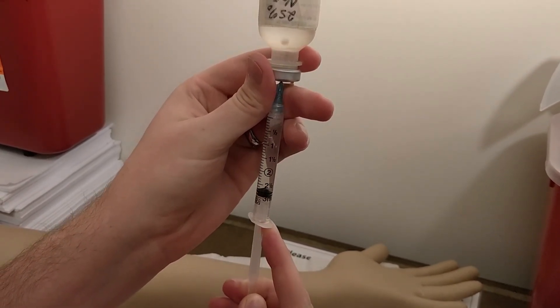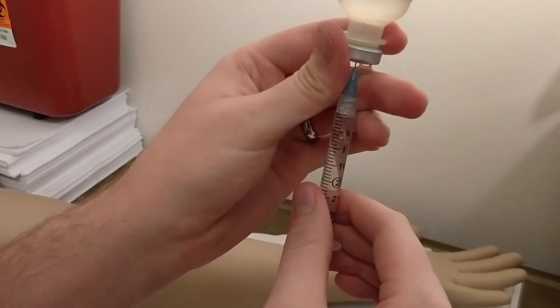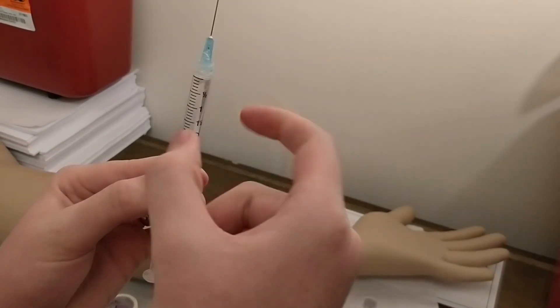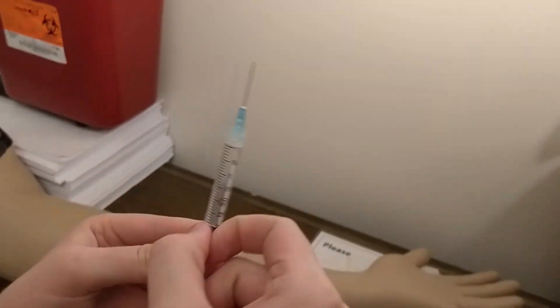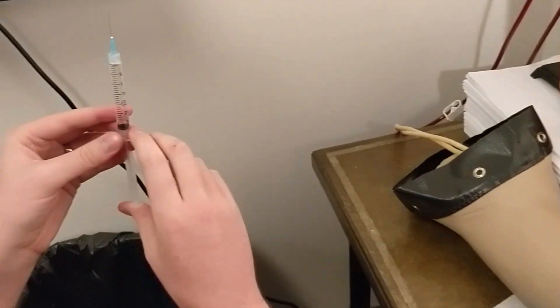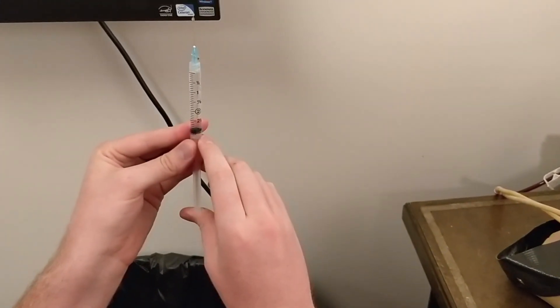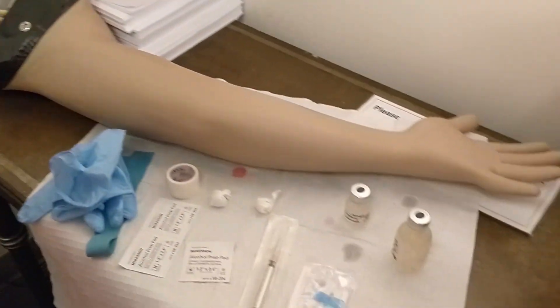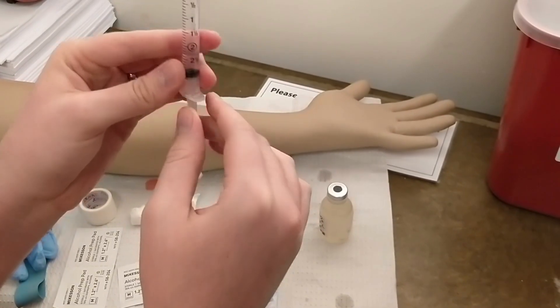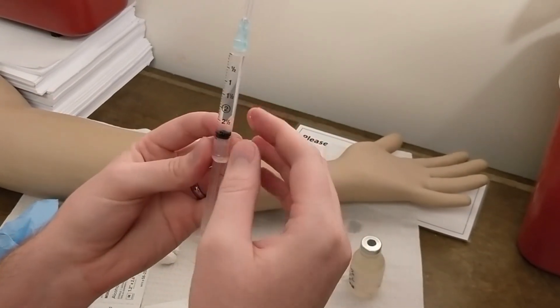Pull back past the three milliliter mark — but due to this syringe type we can only pull up to three. Once fully there, remove from the vial. Next, remove all the air bubbles inside: give it a good couple of flicks, checking down by the bottom as well as up by the top to get all air bubbles to the top. Over the trash — not over your aseptic field or the arm — set your syringe to the proper amount: three milliliters. Now do the one-handed scoop technique to recap the needle, secure it, and state what you have. I have three milliliters of 25% sodium fluorescein ready for IV injection.